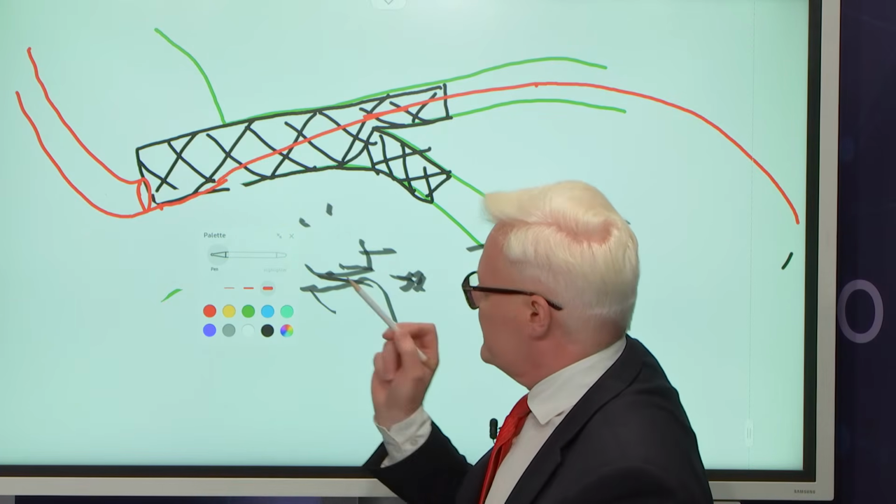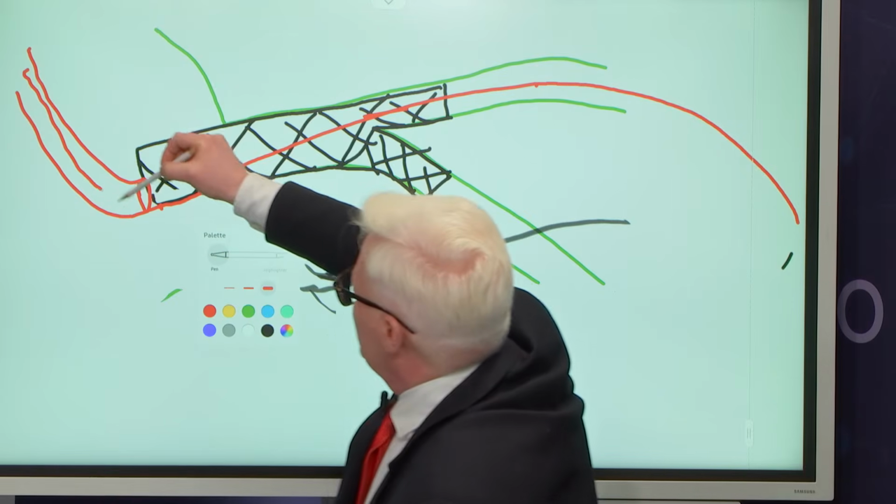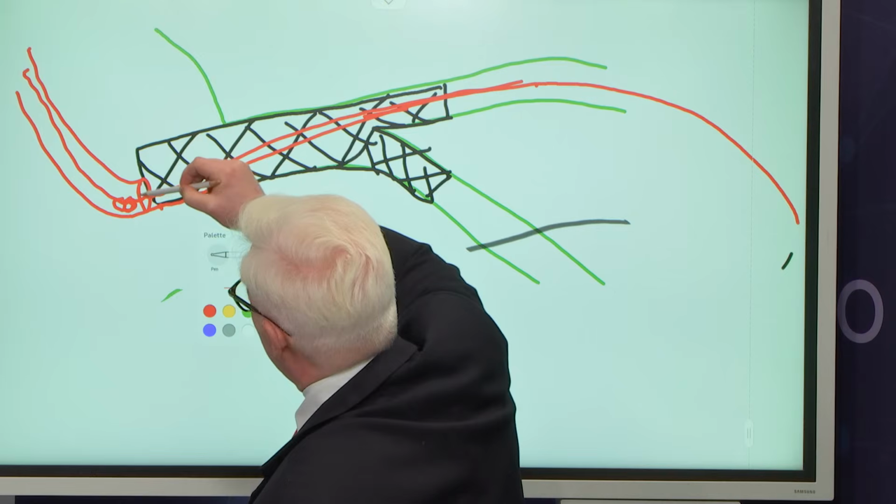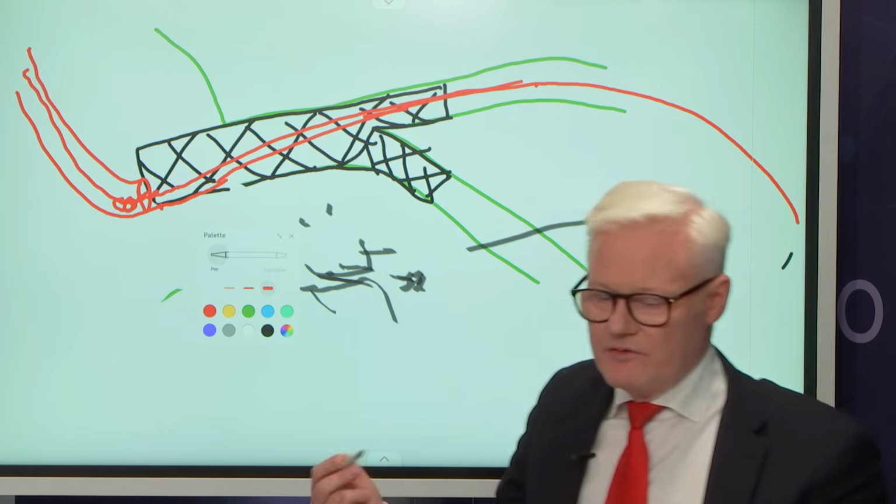And so this is the first trick, to use the first wire to maneuver, to facilitate the engagement of the guiding. But the second is to use another wire, trying to engage the stent, but I always check with intravascular ultrasound if I am going through the lumen of the stent or just through the stent struts.